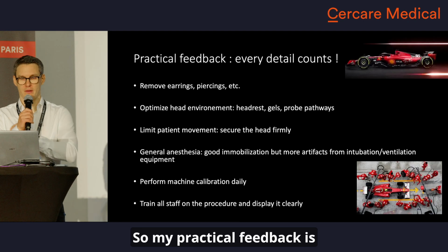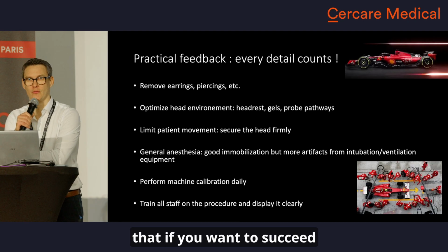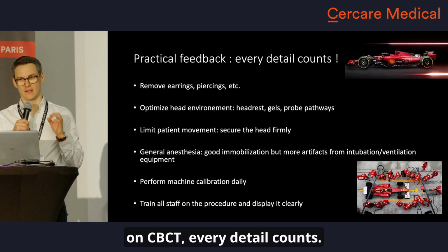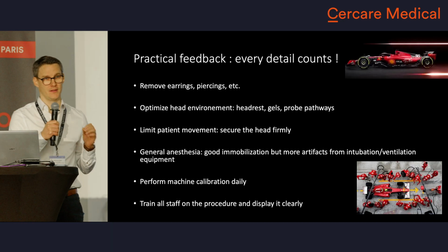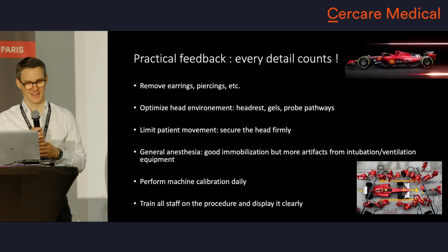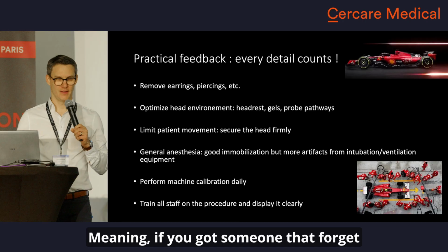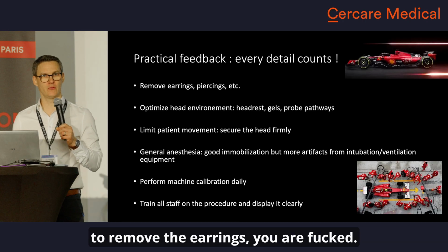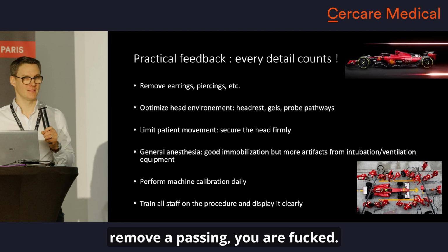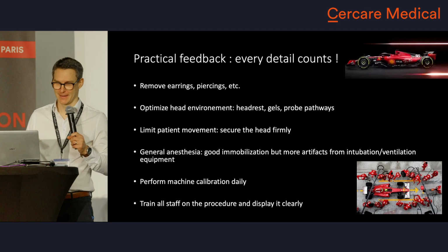So my practical feedback is that if you want to succeed in this kind of perfusion on CBCT, every detail counts. It doesn't mean you need a Ferrari, but you need to be as precise as the Ferrari team. Meaning, if you got someone that forgot to remove the earrings, you're out of luck. If someone forgot to remove a piercing, you're out of luck.